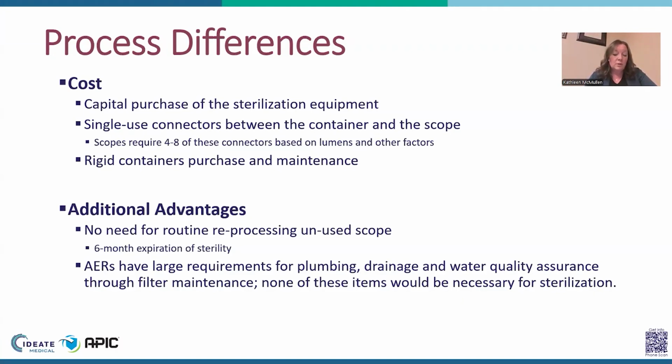The scope group was pretty excited about some of the advantages. One of them is that this current vendor has a 6-month expiration of sterility. So many of us who are high-level disinfecting scopes are reprocessing scopes regardless of use at something like 4, 7, 10, 14 days. It varies quite a bit. With this center, we didn't have a lot of scopes that didn't get used. We are doing every 7 days. We didn't have a lot of scopes that didn't get used at least once, but they still felt it was notable that there will not be the need to reprocess everything every week.